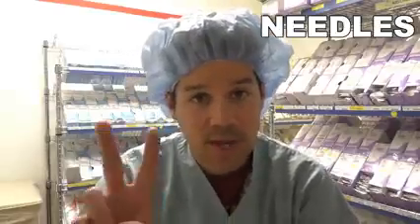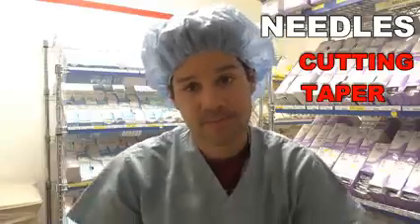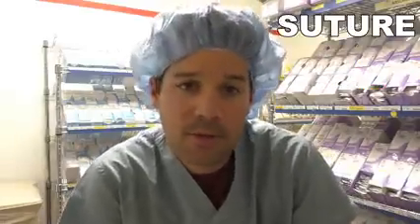Now, why is it used for closing the skin? That subcuticular layer right below your skin is really, really tough tissue. And you need a cutting needle to cut through that tough layer of skin to bring it all the way around and close up that incision. So that's it, needles. Two categories, taper and cutting. Simple.